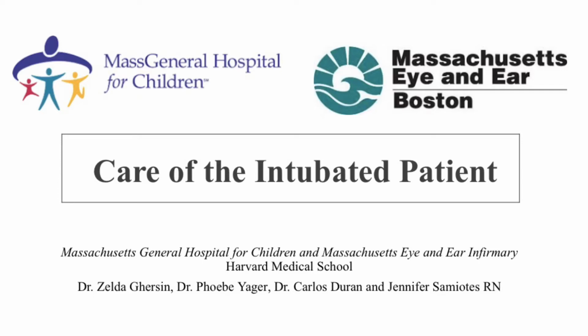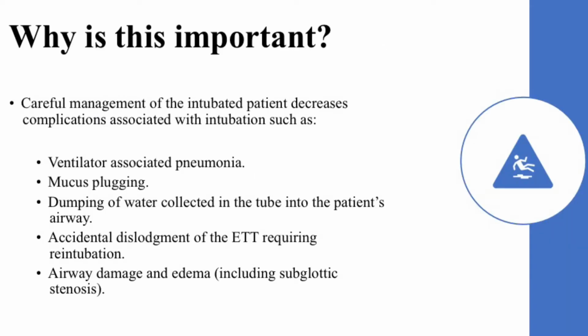Care of the intubated patient. Why is this important? Careful management of the intubated patient decreases complications associated with intubation such as ventilator-associated pneumonia, mucus plugging, dumping of water collected in the tube into the patient's airway, accidental dislodgement of the endotracheal tube requiring reintubation.